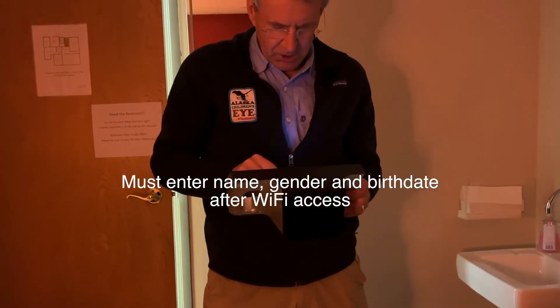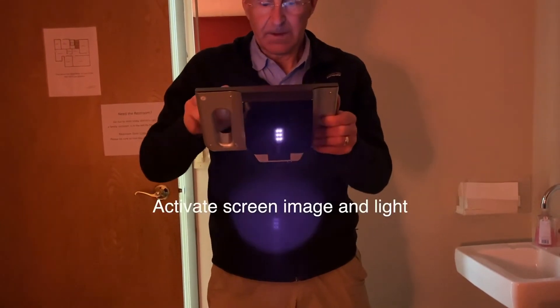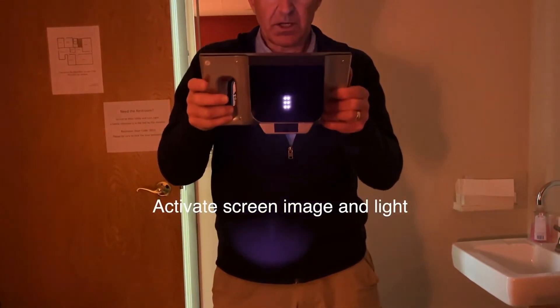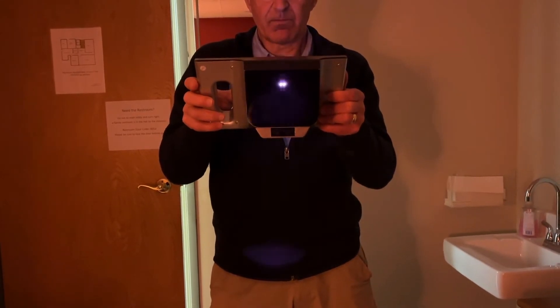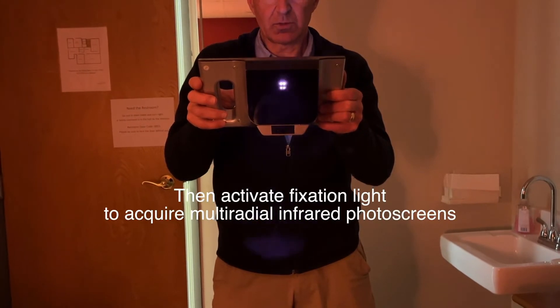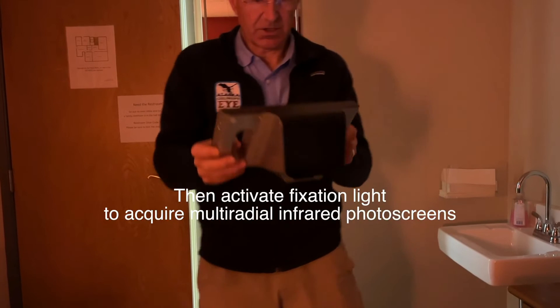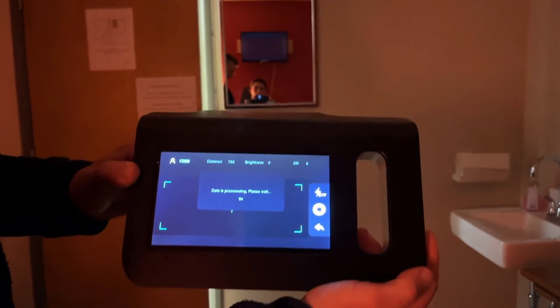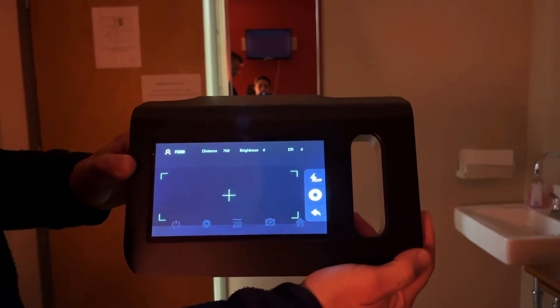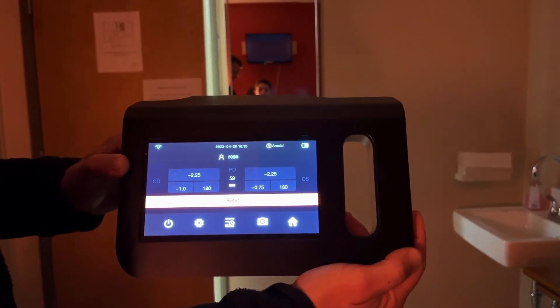All right. Here's yours. We'll get this one like this, then it's gonna be looking at you at a good distance. Now it's done its thing. Data is processing. And it gave you a refer. Also, it thought you had a little bit of nearsighted astigmatism in them.